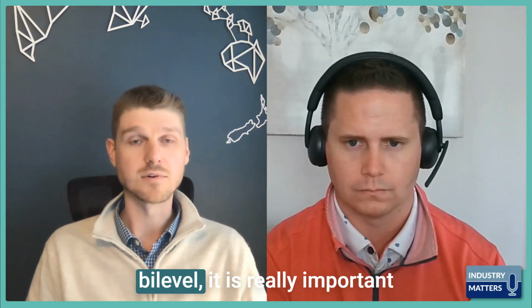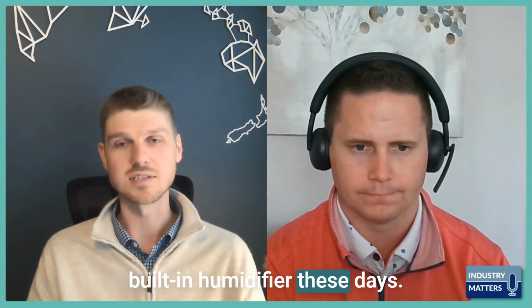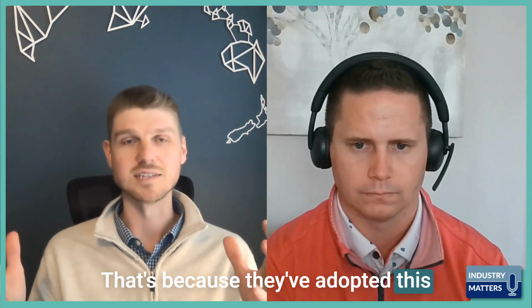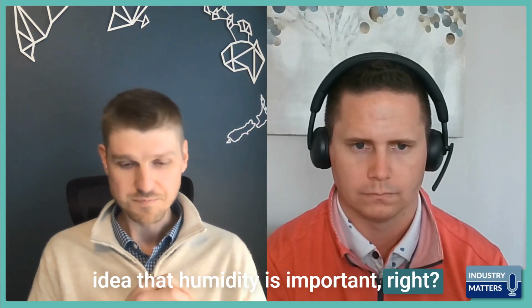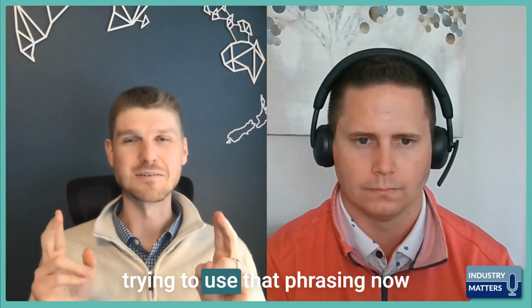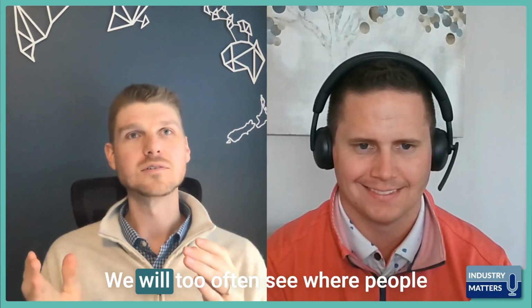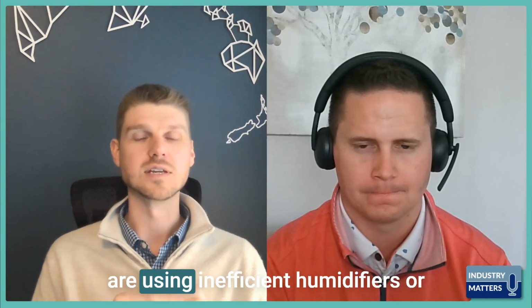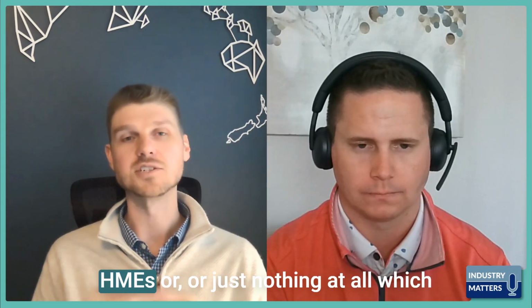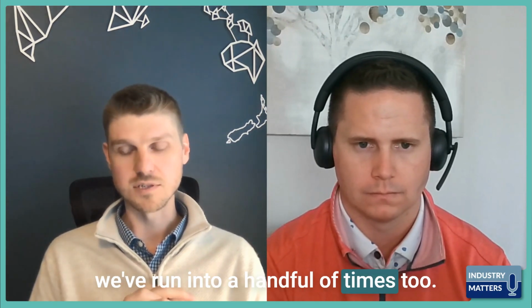I think for CPAP and bilevel, it is really important to include humidification. And you'll see most CPAP machines and bilevel machines have a built-in humidifier these days. That's because they've adopted this idea that humidity is important, right? But then when you get to home mechanical ventilators, and I'm trying to use that phrasing now with the new NCD and all that stuff, we will too often see where people are using inefficient humidifiers or HMEs, or just nothing at all, which we've run into a handful of times too.